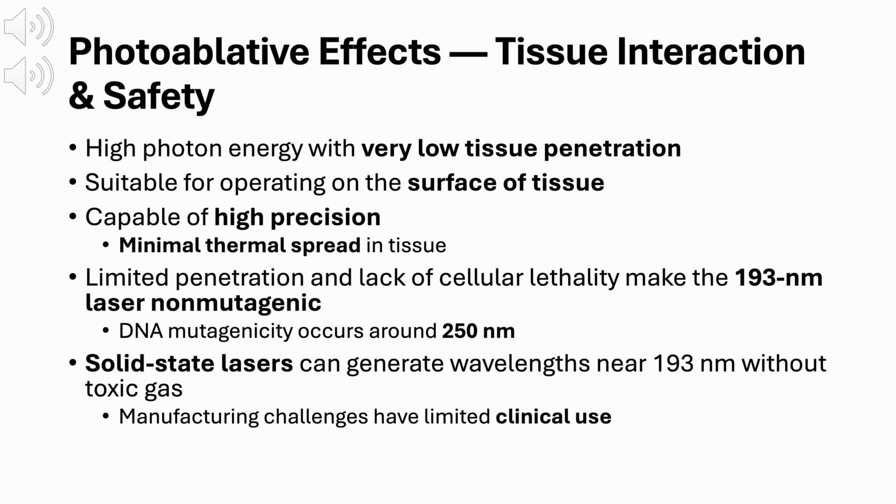This combination, high photon energy, low penetration, and minimal thermal injury, explains why excimer laser ablation has such a strong safety record despite operating in the ultraviolet range.